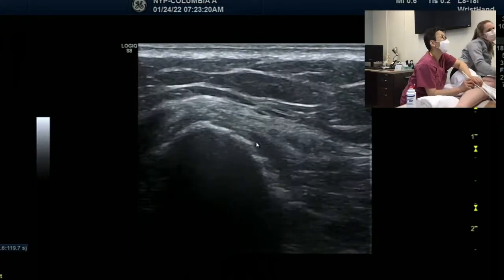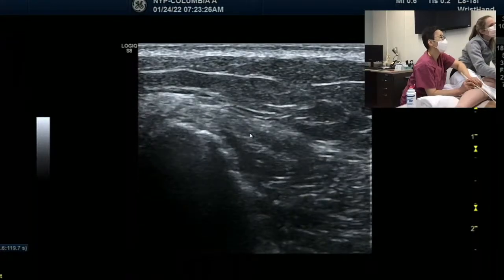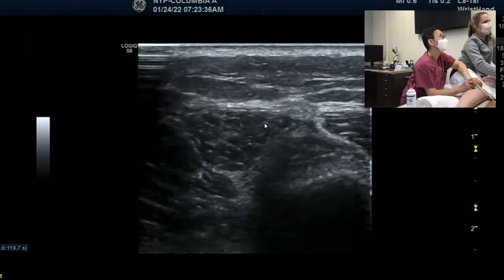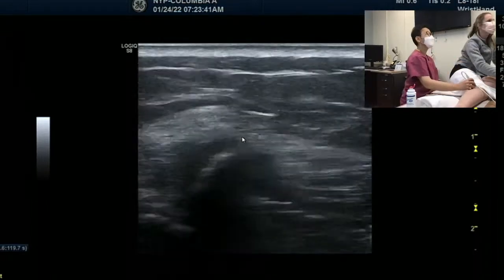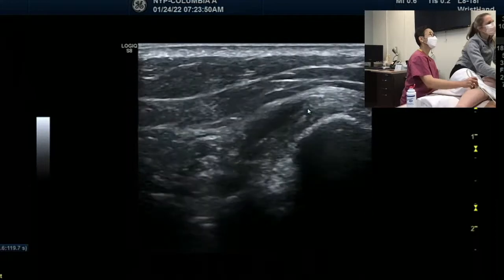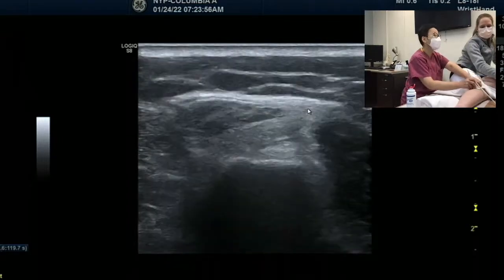Debbie has to use my leg, but just a little bit later. Okay. So here, you still see the common peroneal nerve. No, no, no, right side. That one, yeah. And then it's moving, right? There it is. I'm going into the peroneal muscles. Oh, that was the last one. Here, on top of the bone. Yep, the white honeycomb that goes up. And then I'm going around the fibula head.